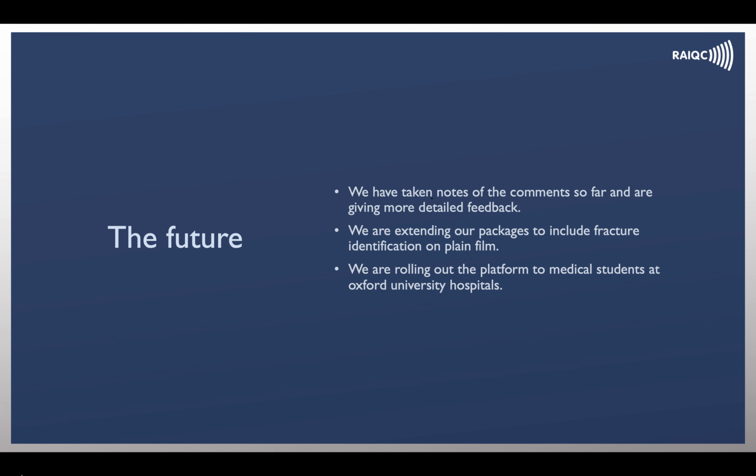So, where do we go from here? Well, we've taken on board the comments we've received, and we're improving the detail of feedback that users receive. We're extending our packages to include fracture identification on plain films, which we hope to roll out in the coming months to medical students at the Oxford University Medical School.